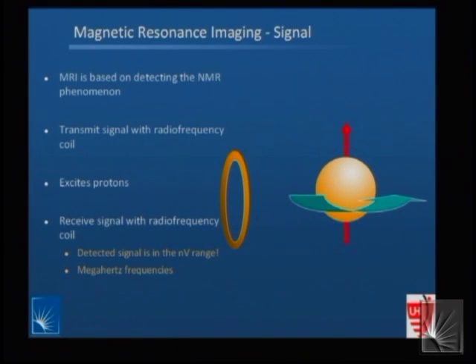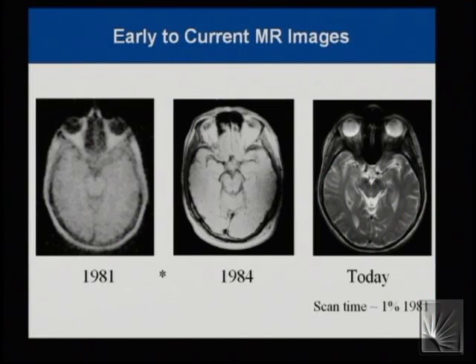You know, thousands or hundreds of volts, for example, and hundreds of amps going out into some particular coil to create that field. And yet the signal that I get back may be only nanovolts in strength. So that same coil that I'm going to use to send out that pulse, a few microseconds later, I may need it to switch from being in the hundreds of volts range into the nanovolt range with excellent sensitivity and excellent signal to noise. And we're going to talk about some of the ways we do that.